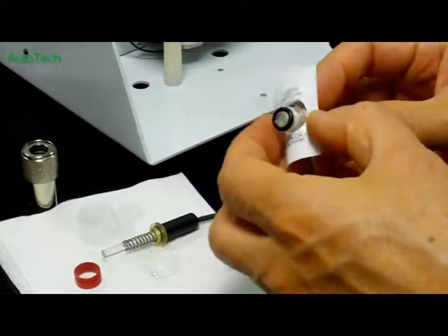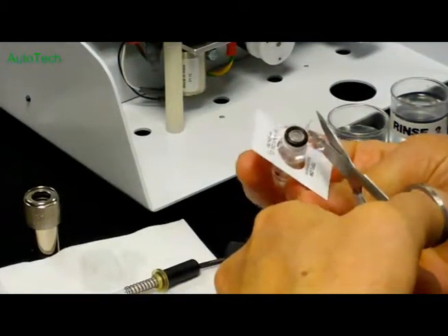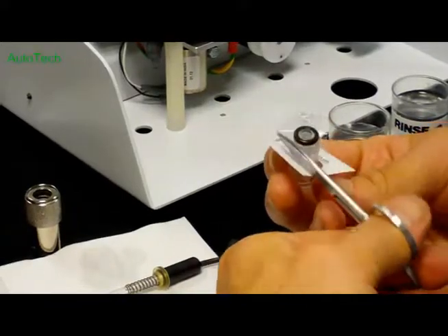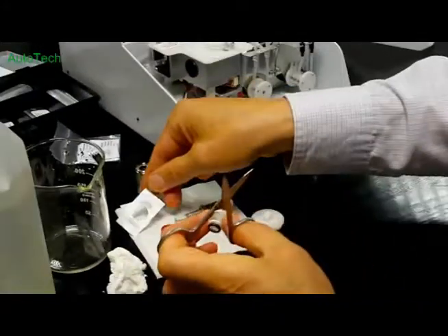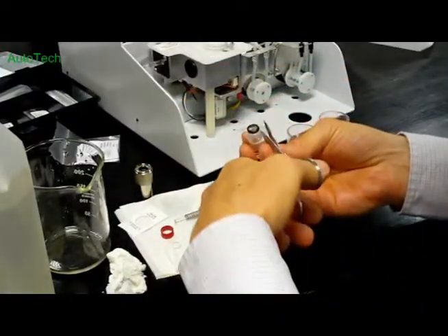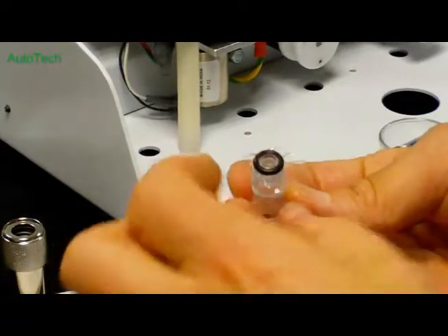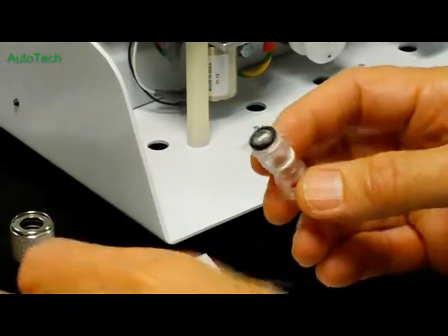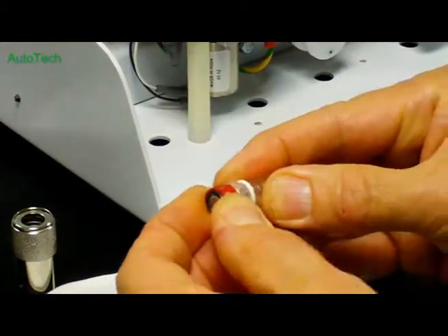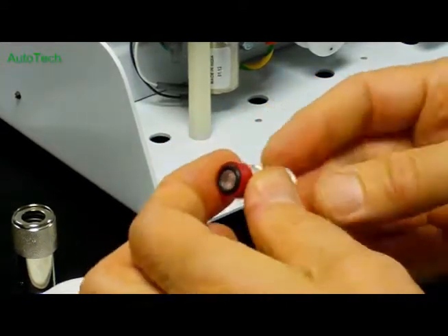and then using the scissors just cut around the membrane to remove the carrier. So, and then we can trim that a bit more. Doesn't have to be trimmed close, just the excess. So have a quick look at the membrane, you can see the membrane is perfectly flat. Now we can put the red crown in place. That retains the membrane mounting ring better.